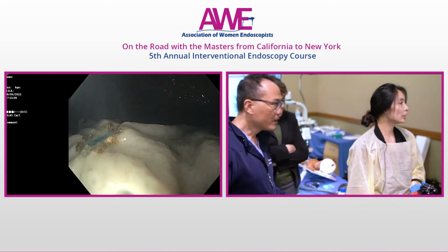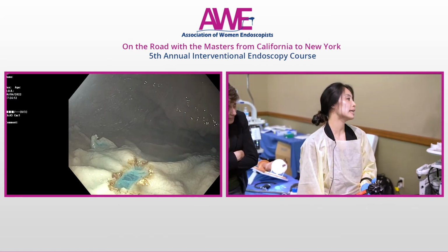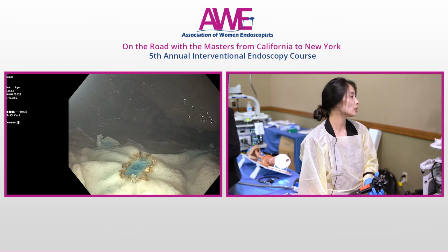So what you want to see when you've done snare tip is a margin of ablated tissue, just like we're seeing there.